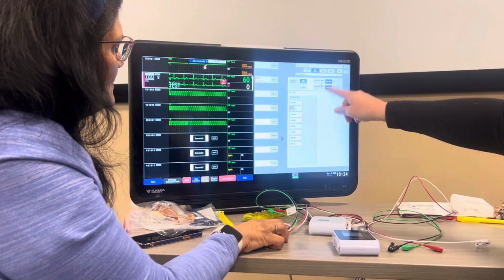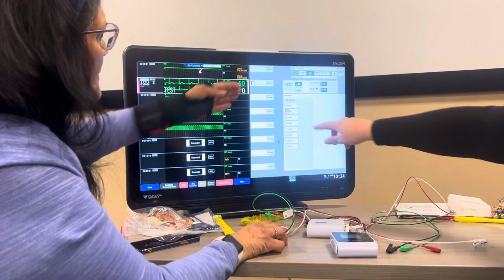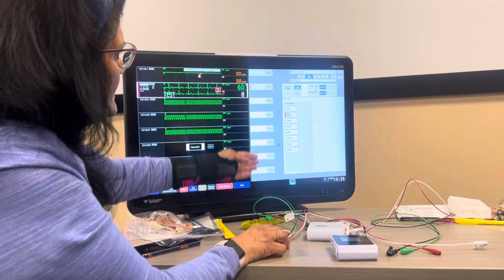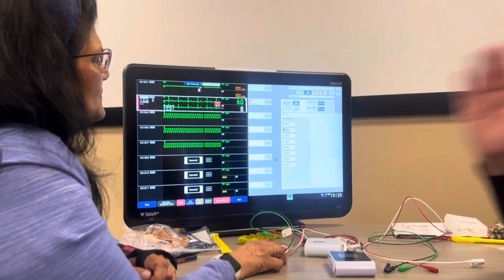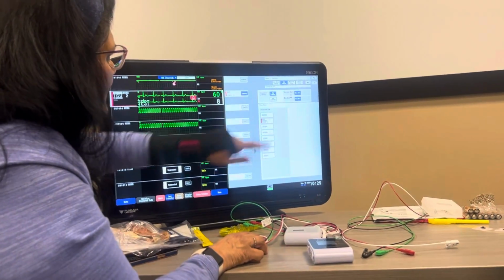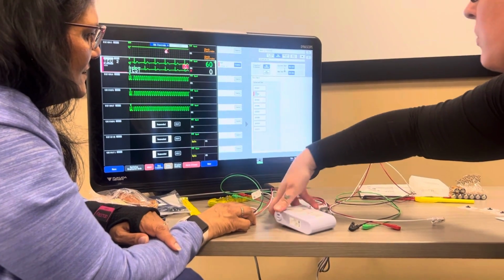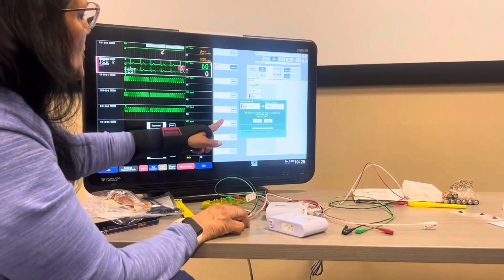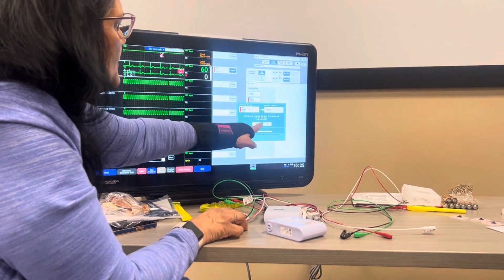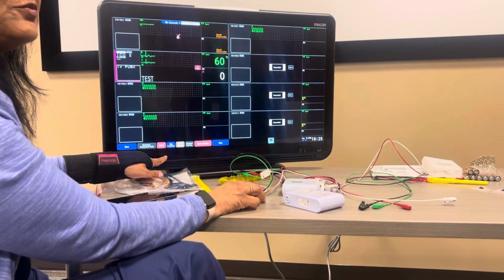So in this unit, do we have to select our bed? Yes. So we would select this one? No, you're going to select on this side. Okay, so since we're transferring this one, we would click transfer on that one. And then we would select the new one? Yep. It's just asking you, are you sure you want to transfer, and you say yes. Oh, okay. Perfect. So we feel comfortable with the bed transfer?